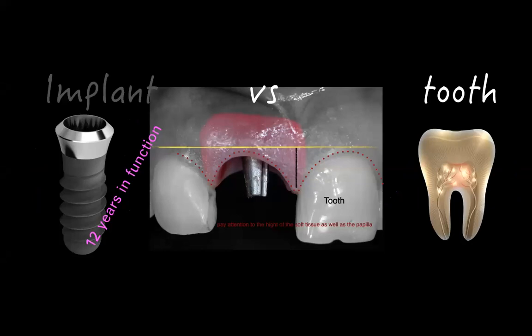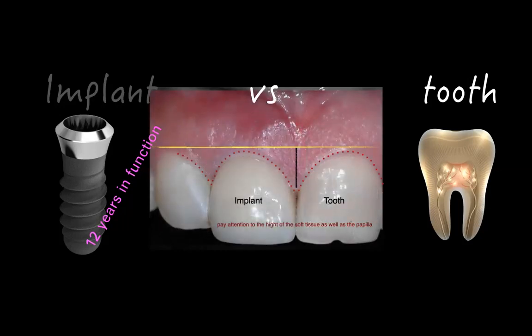Here is another case. Again, take a look. These are all my old cases where all cementable. Okay. A patient had a tissue level implant. This is a solid abutment, no modification on an abutment, and the crown was made. And just take a look at the soft tissue. Okay? Now, going back to what we discussed as far as the movement of the teeth. Here, it did not move.